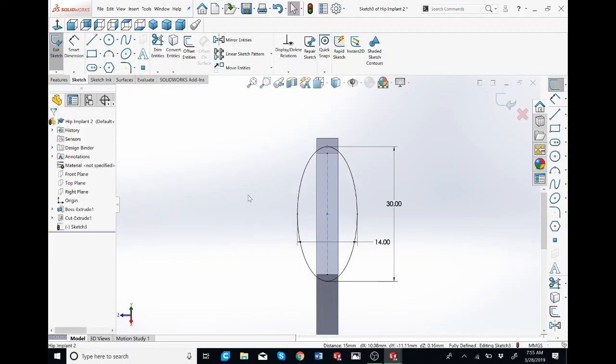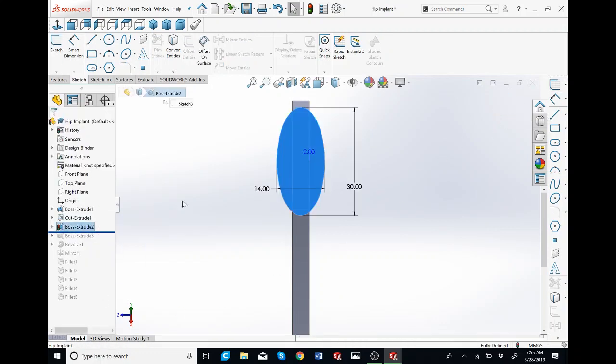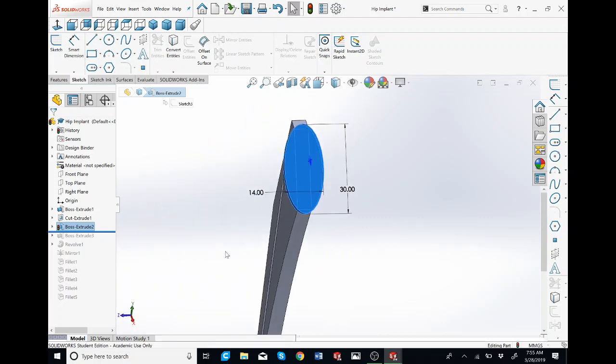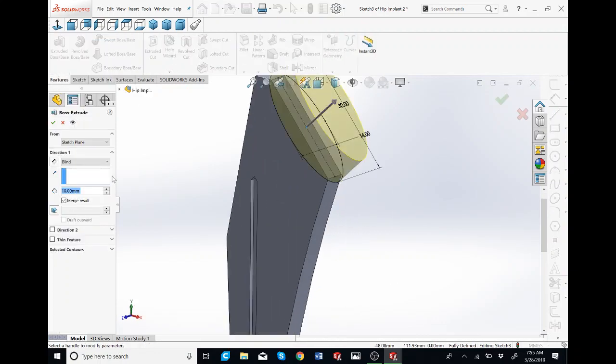Exit out. I'm going to go back to my other model to see how much I extruded the boss. I extruded this by 2 millimeters, and you could rotate the model by clicking on the middle mouse button and dragging it, which is the scroll wheel button. So 2 millimeters, I'm going to go to my features tab, extrude boss, 2 millimeters, enter, check.